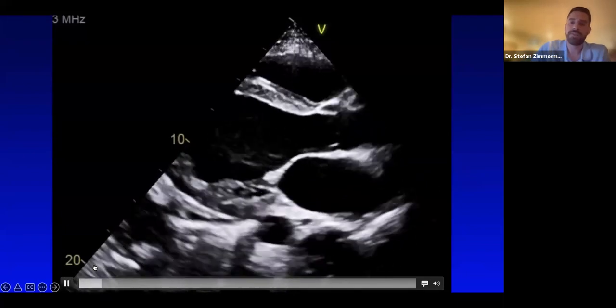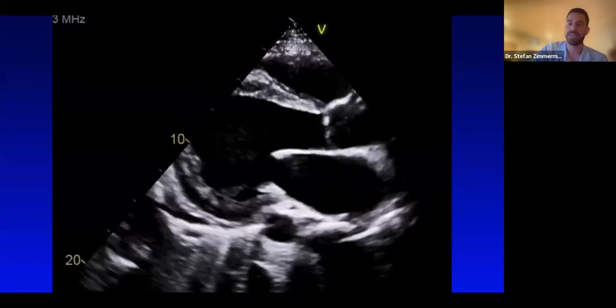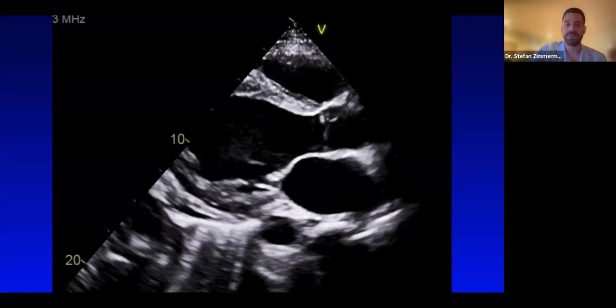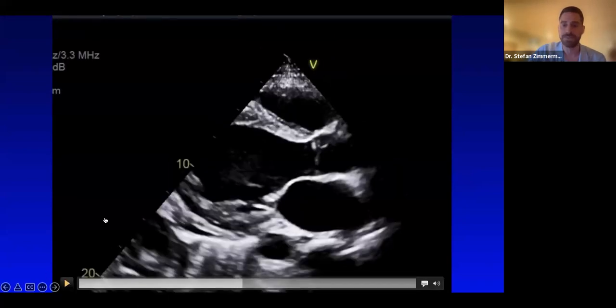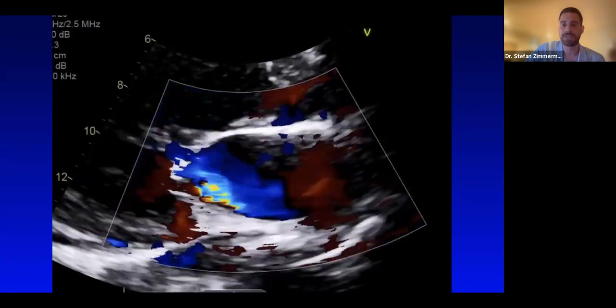So echocardiography is a great test. It's easy because all you do is put that probe on somebody's skin and you can take a look. Now, it's not so easy that I could just do it walking off the street. I don't do echocardiography, and it takes quite a bit of training to know how to get the right views. But in the grand scheme of things, as far as patient preparation, it's very easy to put somebody on a table. And as long as you have a knowledgeable person who knows how to use the machine, it's very easy to get images. Relative to other things, it's fairly cheap and fairly quick. And so it's a really nice test that you may be asked to do at some point.